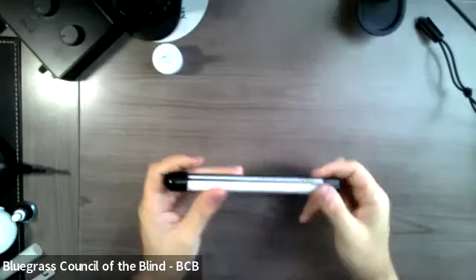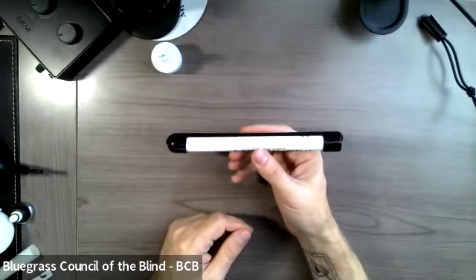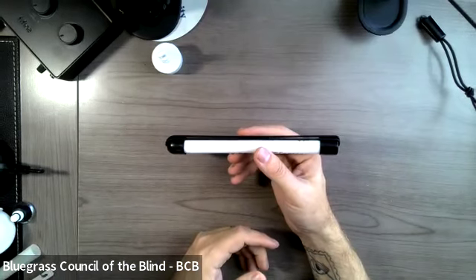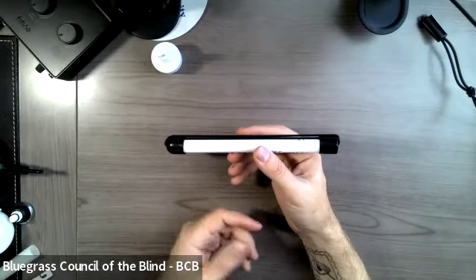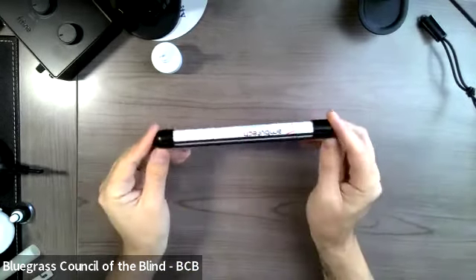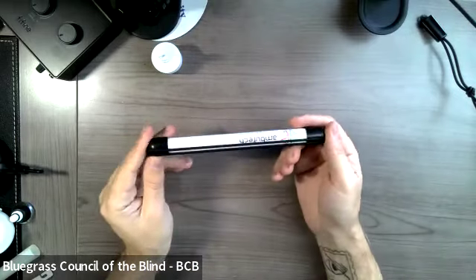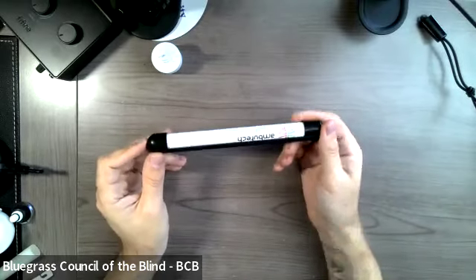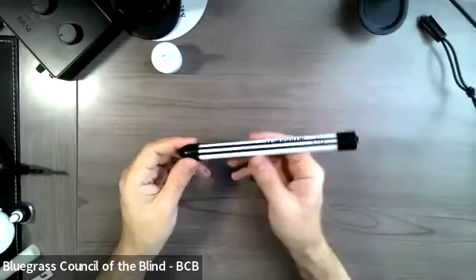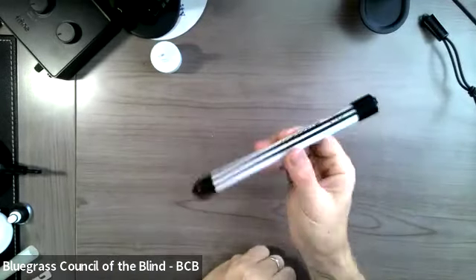And this is simply to identify you as being visually impaired. So for someone that maybe has a slight impairment where they don't need a cane for mobility, but they still want to be recognized as being visually impaired, they can just carry one of these types of canes. Now, as I said, here in the US, I don't know a lot of people that would recognize what you were carrying as what it represents, but this is much more popular in Europe. I know a lot of people use these types of things in European countries, but still really interesting.